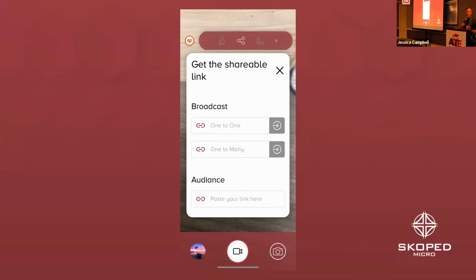In a telepathology world, it's coming. Digital pathology is going to be the future, and the technicians that we are teaching are going to deal with it. There's all kinds of stuff out there that's in the pipeline, but I'm kind of hoping that we fit the middle of that and can bring it to a little practice like mine. I'm not going to be able to buy a slide scanner. I'm not going to be able to say, yep, we're going to do 2 every day. It's not going to happen, but I can do a couple a week. And so we're probably going to be the intermediary to bring that to everybody, is my hope.